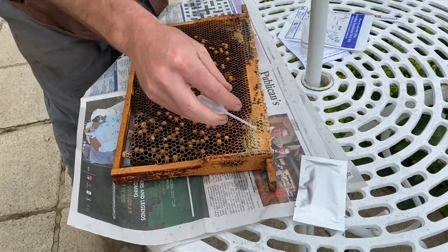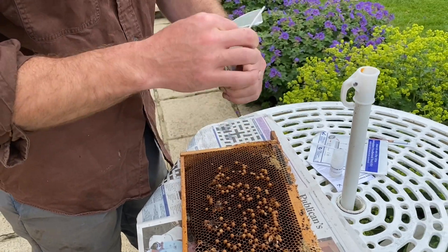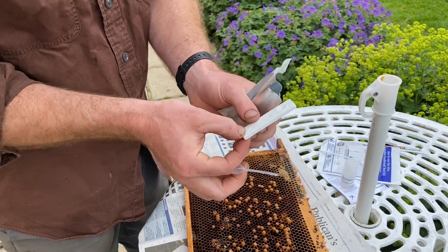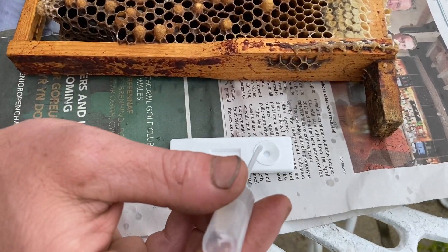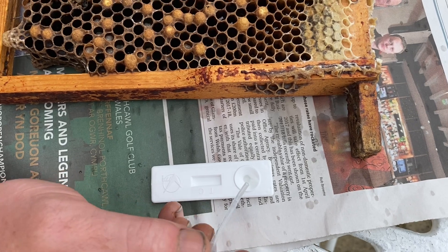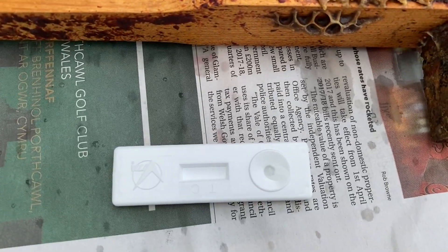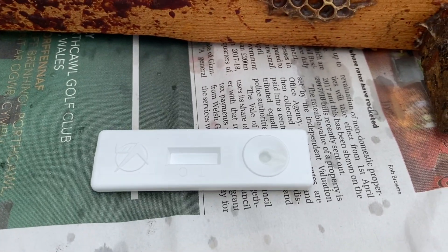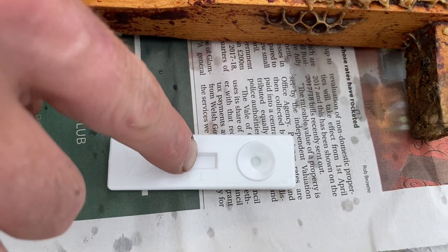Then we're going to open the field kit — the whole point of this test is you can do it there and then. We're just going to put not too much in there, just about that much, maybe one more drop, and then we've got to wait. Always nerve-wracking this bit, and we'll see the solution coming down.